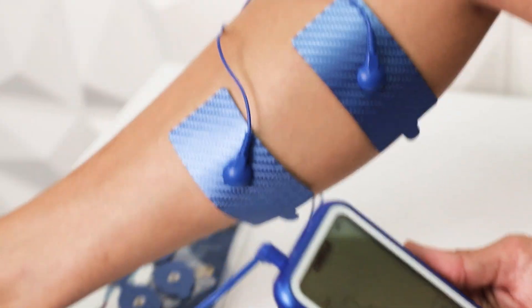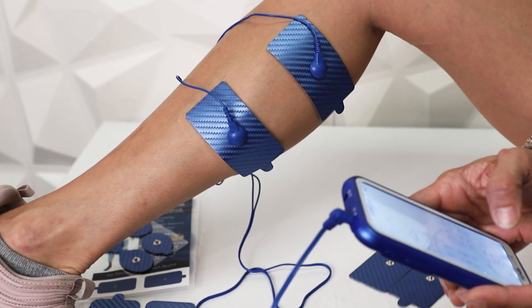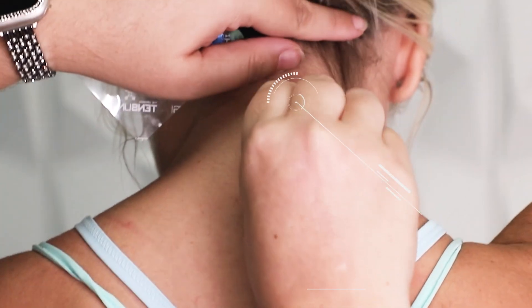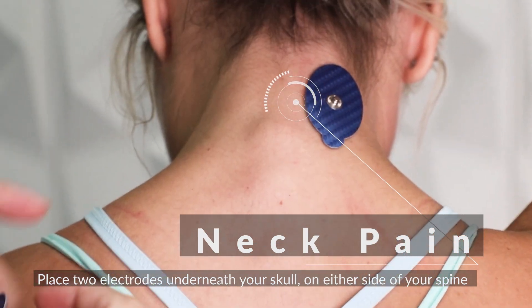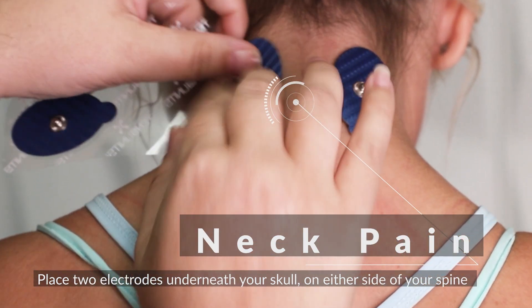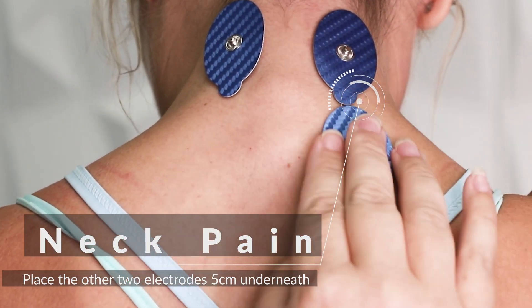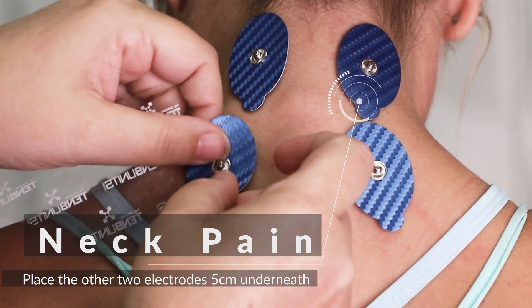You know your body, so modifying these placements will do no damage and there is no wrong way to place your electrodes. For neck pain, place two electrodes underneath your skull on either side of your spine. Place the other two electrodes 5 cm underneath the first two electrodes.